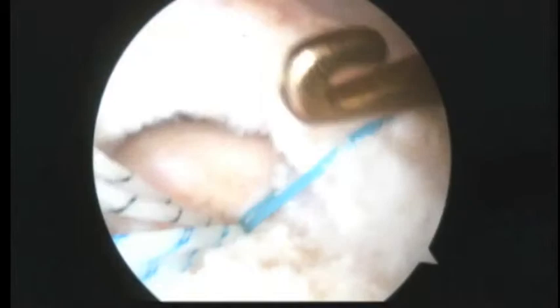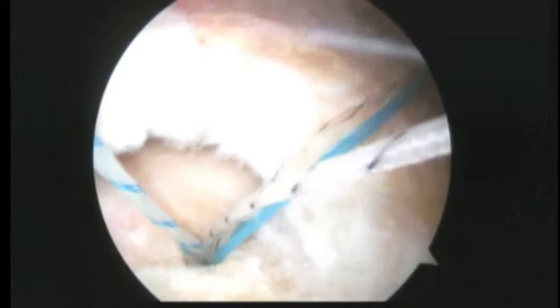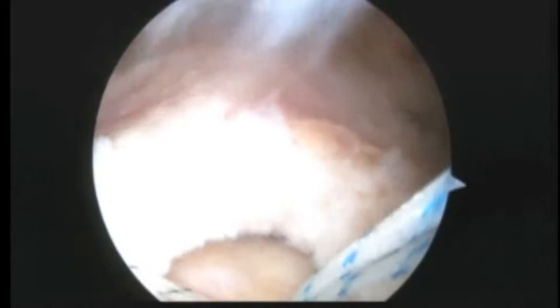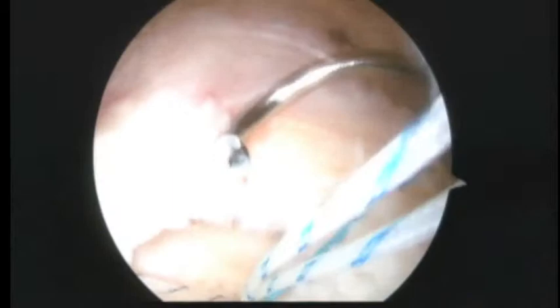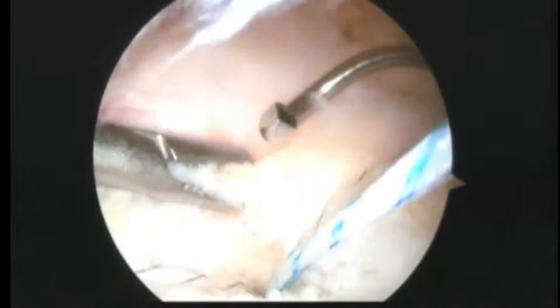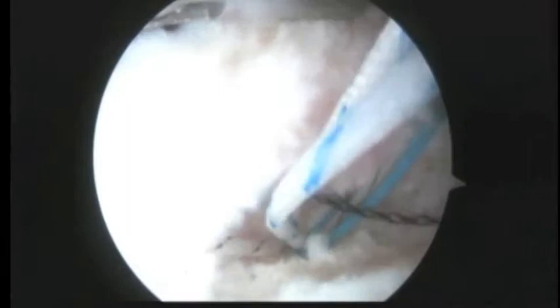You can see how that brings that blue suture back through. Then here we get the partner suture. We're not going to tie these yet — we're going to tie them all at the end. It looks like we're going to use that black and white one next. We'll take the other black and white one out the front, which is to the left. The next stitch is going to be with a slightly different angled hook — this one has more of a curve to it. We'll take the grasper and go down about here — there you can see it coming underneath.